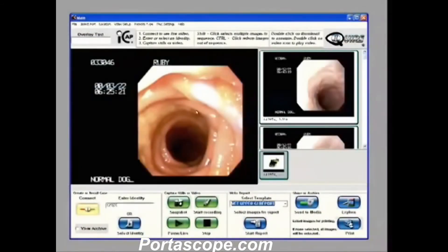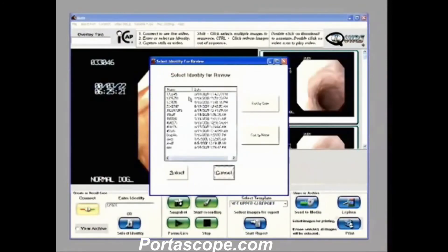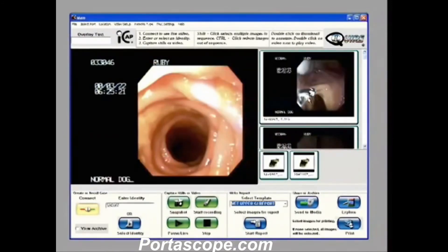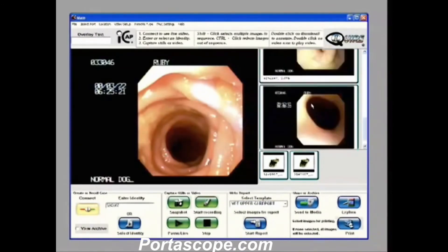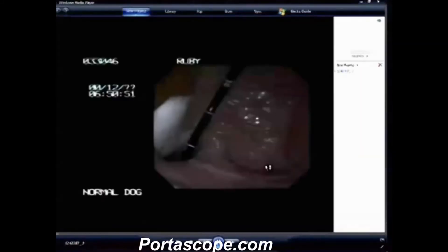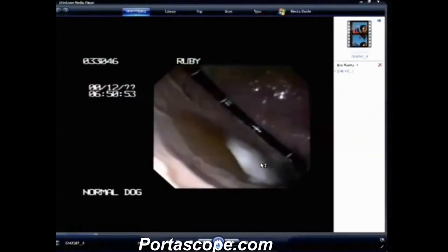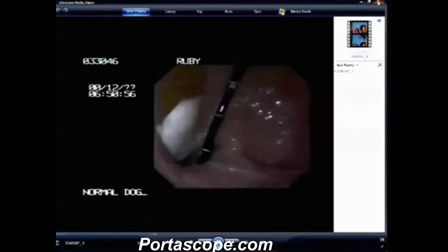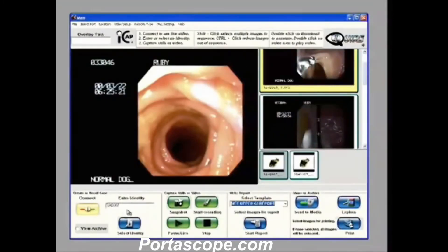From within the iCAP interface we have the select identity box. By hitting this button it brings up a box that has all the listed identities which are on the system. If I click on any of these identities it loads the images for that identity. Here we can see those images — we can print them, annotate them, create reports, come back, and watch the videos that were recorded. iCAP is going to file everything by the identity or case number, making it easy for you to find when you need them later on.